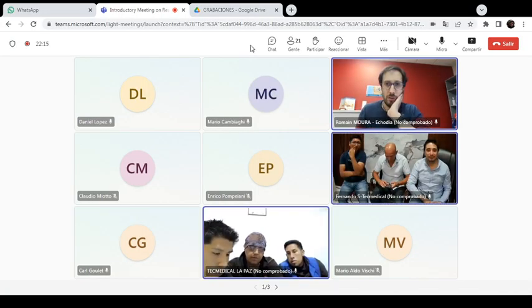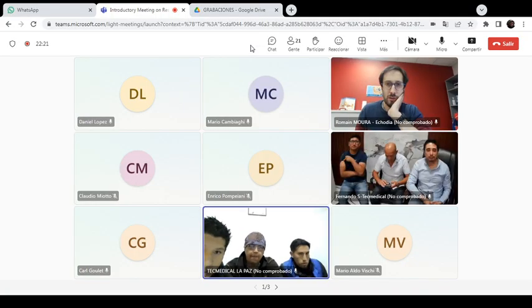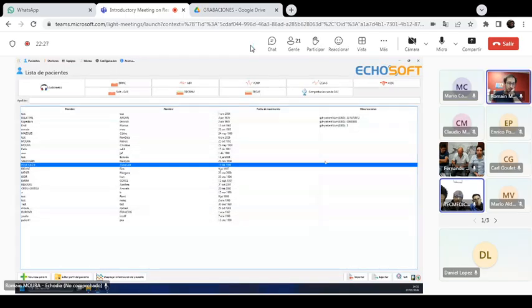Like in summary, the 2 channels of stimulation. Yes, there is 1 channel for the stimulation of the ear you want to test. So the stimulation will be a click or burst, or a chirp in the case of screening, and the second channel will be used for masking. So you can select this.